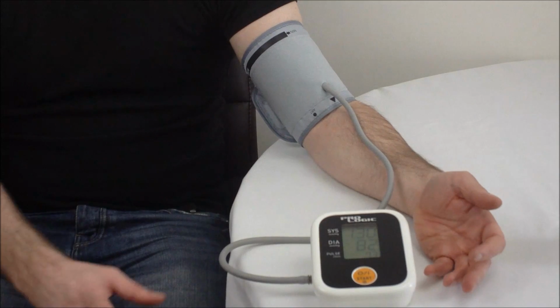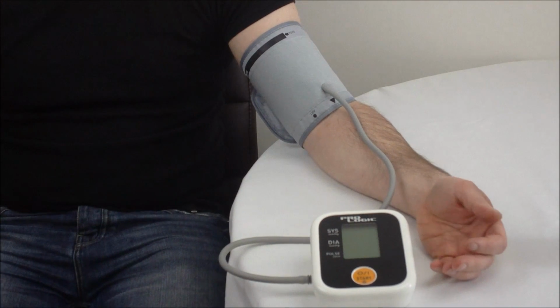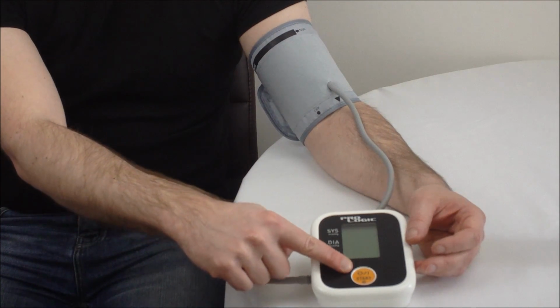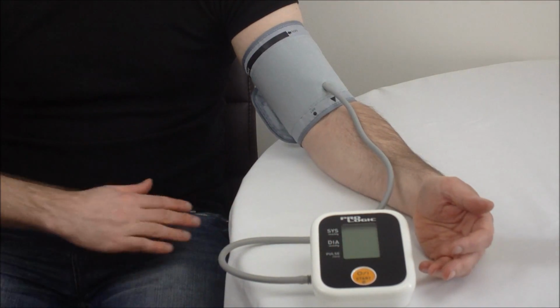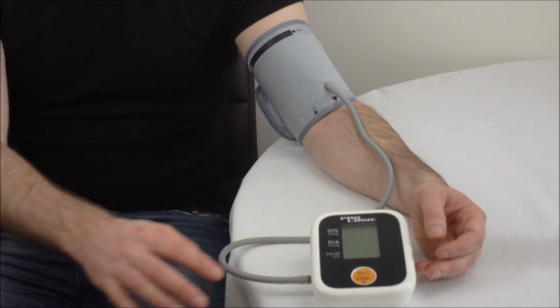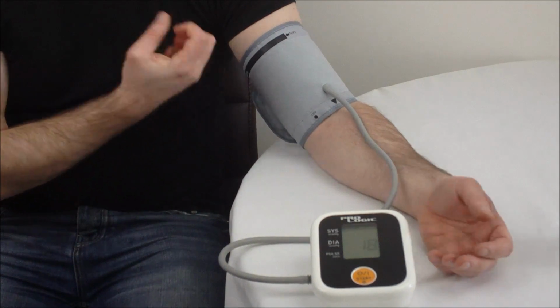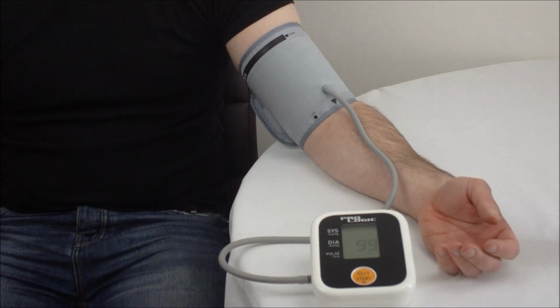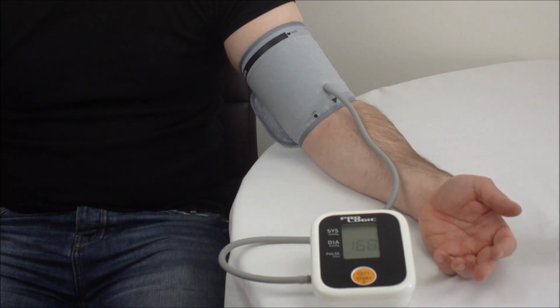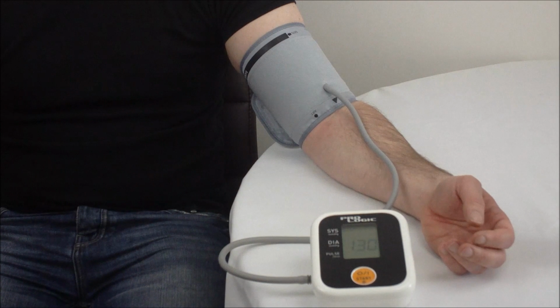After 5 minutes has gone by, you're then ready to begin the test. So in order to activate the monitor and begin the blood pressure measurement, you're going to press the orange button in the middle. At this point, it's important to have your feet firmly on the ground, and you should have been sat comfortably for 5 minutes. On pressing the button, there'll be a short delay, and then you'll feel the cuff start to inflate. It's important that at this stage you keep very still, don't talk like I'm doing, and no moving around, as this will affect the result.